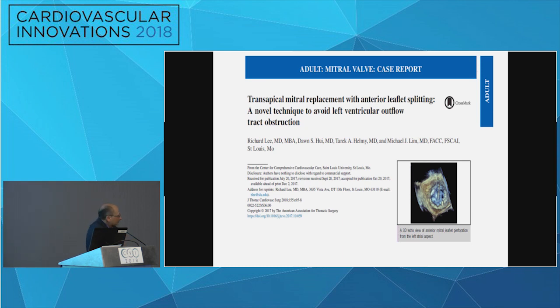It's a great case, and a bunch of us, under the leadership of Guerrero, published the 1-year outcome of the valve-in-MAC registry. What was interesting was that up until this point, there are more commercially available valves put in the mitral position than all the dedicated transcatheter mitral valves combined. And they're still in trials though, right? The dedicated devices, right. There are more commercial cases done with the SAPIEN valve than all the trial valves combined.